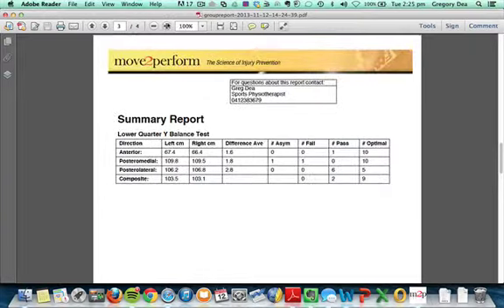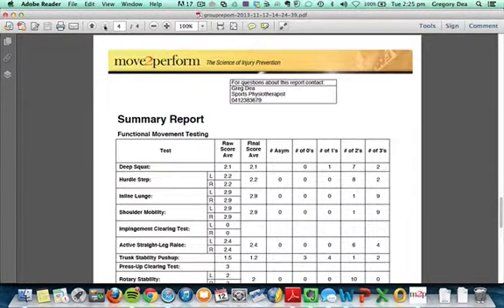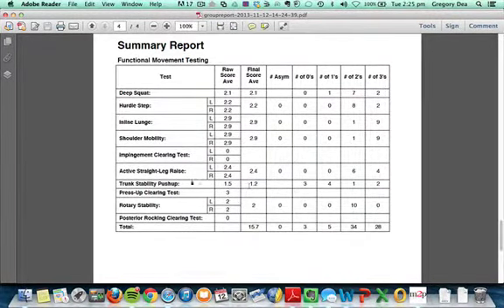You get a group summary for the average asymmetries and the average reach distances for that group, and you get the average FMS data. We can see that the group trend is for some poor trunk stability push-up testing, so in our group testing we can go ahead and do correctives and basic upper limb strength training to improve that trunk stability push-up test. We don't have any significant asymmetries between the group that's showing up. You can see those zeros showing up there, which is great, but there's our main trend, and that's where we get our bang for buck.